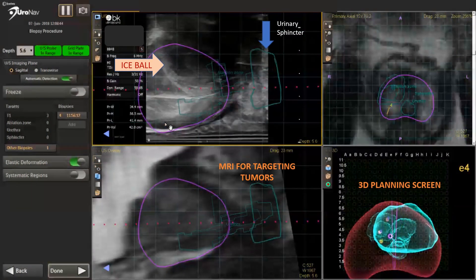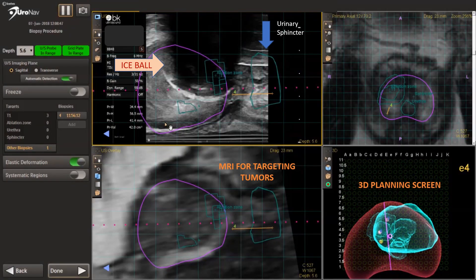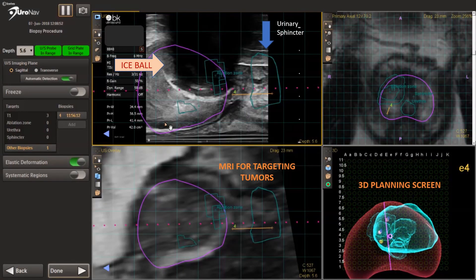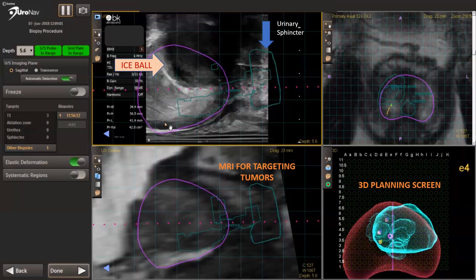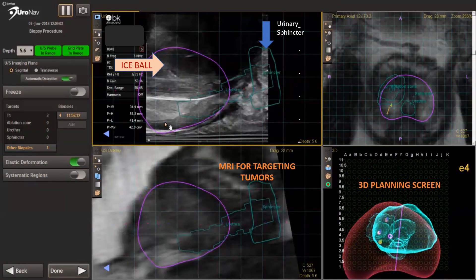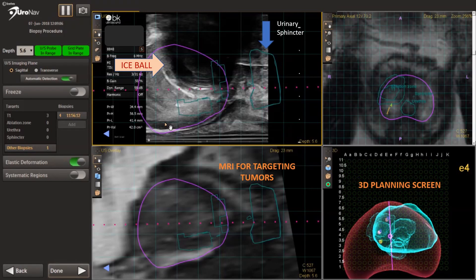After some time, the ice ball reaches a significant size. As seen here, it's covering the entire ablation zone. The urinary sphincter, where the blue arrow is pointing to in the top middle of your screen, is actually untouched by ice. We're very cognizant of this area, because this is where the risk of urinary incontinence could occur if the ice ball freezes the sphincter.